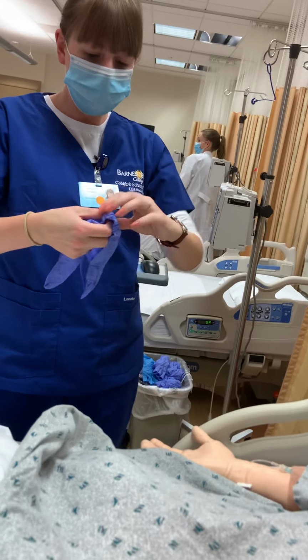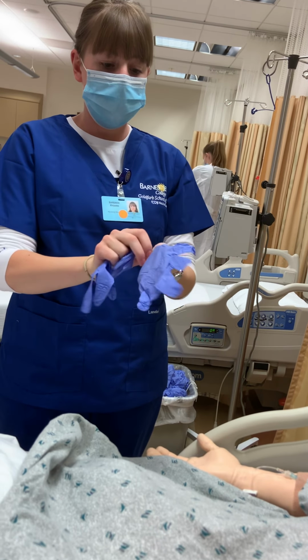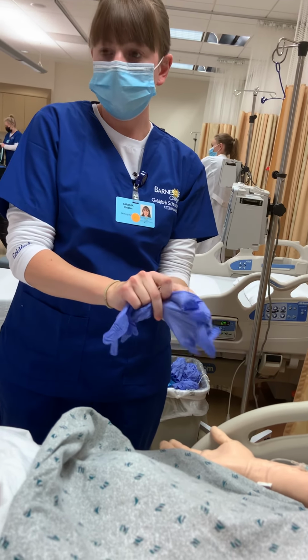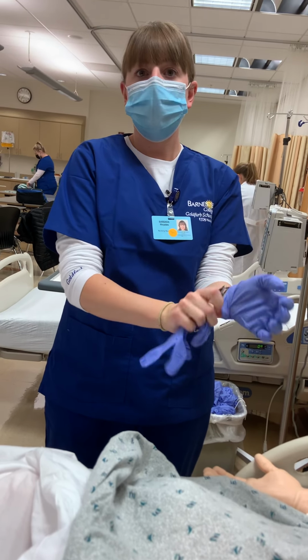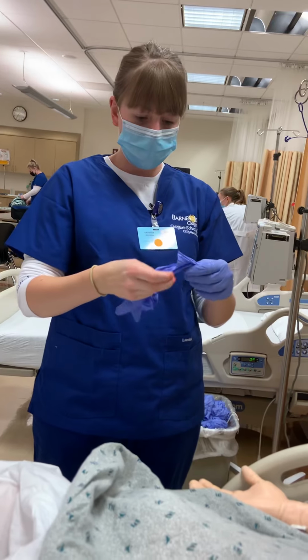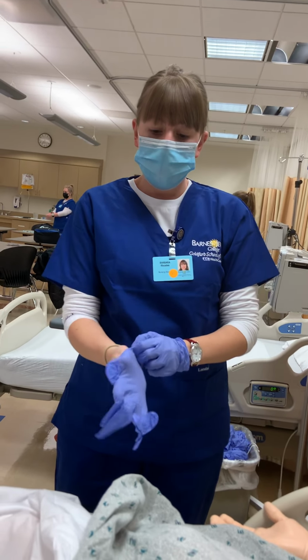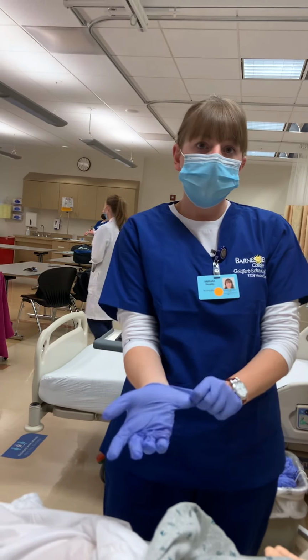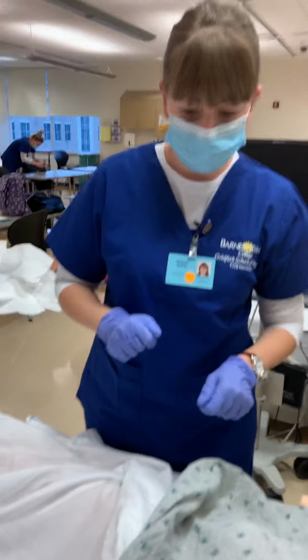Typically, once I'd be done with inserting the catheter, I would probably get the urine sample right away and send that to the lab, or the order may not come until later from the doctor to get that sample. I would leave a document for the day, and then at whatever time I got a new order that said to remove it, I would come back. But for this video, we're just lumping it all together.